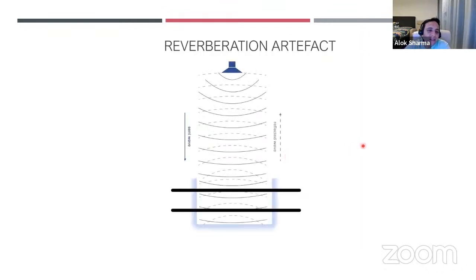So what is happening is that the lung ultrasound is going through, sound waves percolating through. They hit the pleural margin and then they hit lung tissue. And then you basically have them reverberating back to the transducer, but you have them reverberating back against these two surfaces, the pleural margin and the lung tissue itself, to kind of cause a shaking in these areas, and these are horizontal reverberation artifacts.